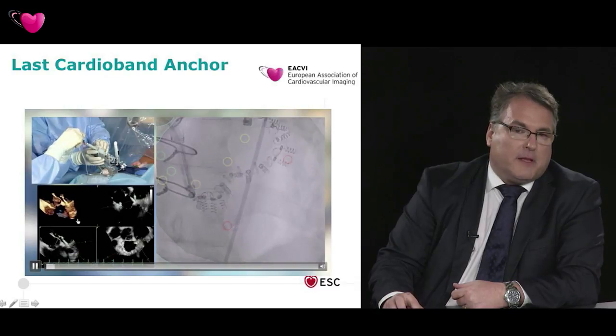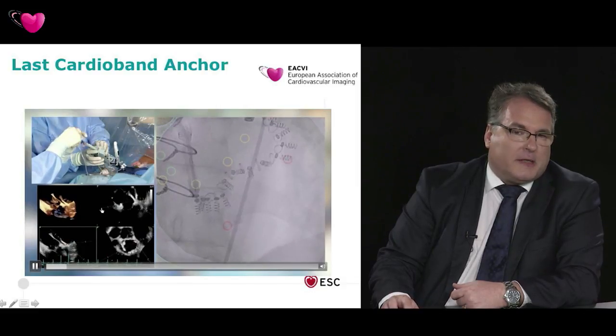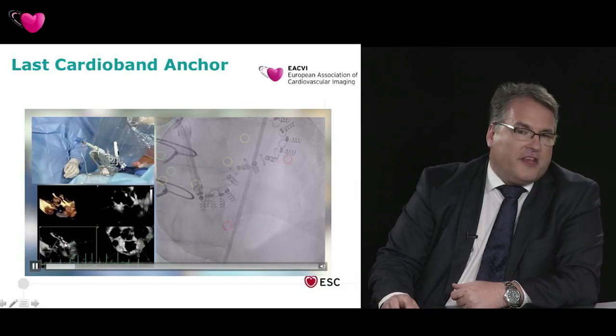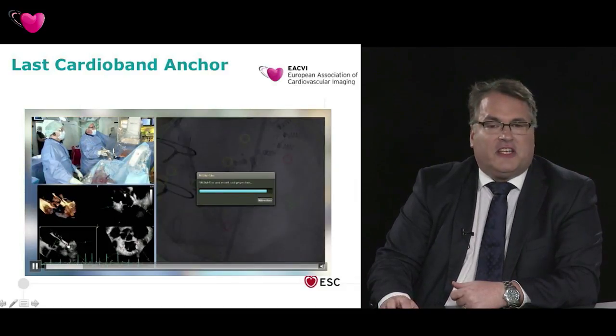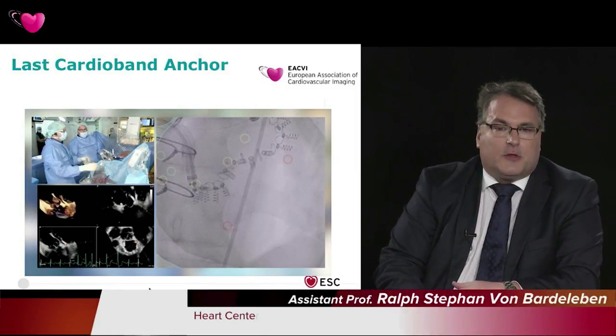You see multiplanar analysis live during the intervention. So not only 3D full volume, but all the cut planes that visualize the catheter, the orientation of the catheter to the mitral annular plane. Here 45 degrees, 50 degrees to the plane. And I think this is very telling to perform this procedure.